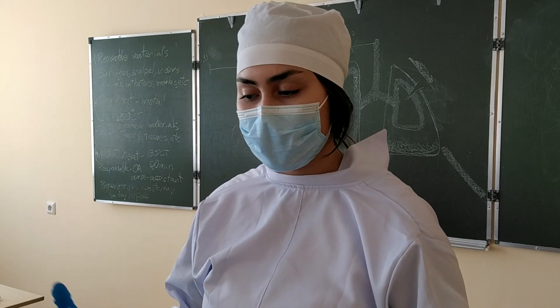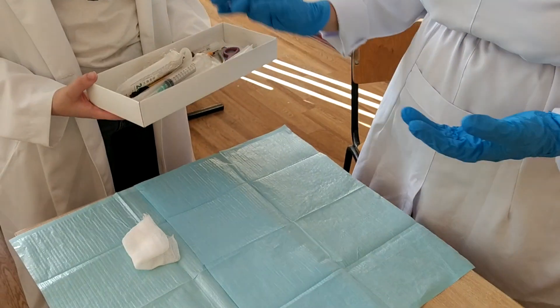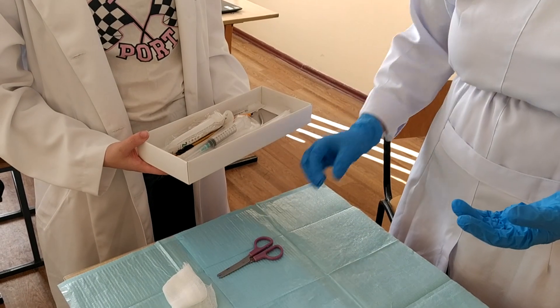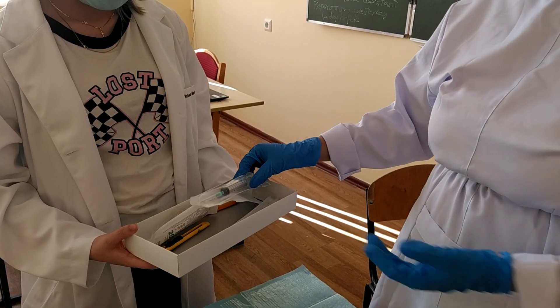If the doctor needs anything else that is not here, you can ask for it. For example, we will need paper tissue, gauze, scissors, and a cannula. For things that are sterile, there is a special way to open them.